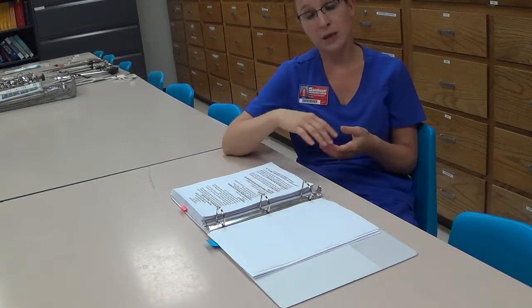On the arthroscopy, again, making sure that they run everything off the unoperative side. Everything goes to the foot of the bed as a guide of how much to keep on the field. Again, tossing those off in the order in which they're going to be used, starting with the inflow and the outflow, and then going to the camera and the light cord, and then a shaver or any other accessory items that they might have. Clipping those up on the field, running off that unoperative side. So attaching the cords for a knee scope.